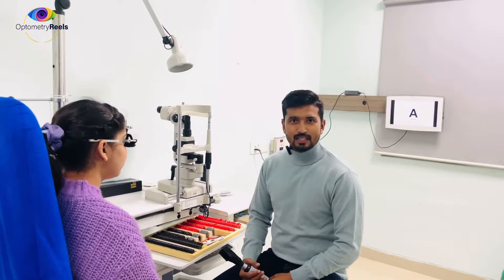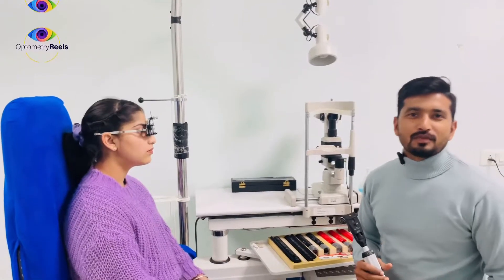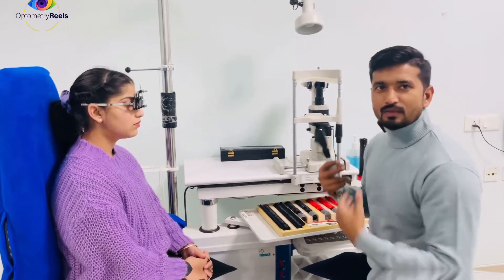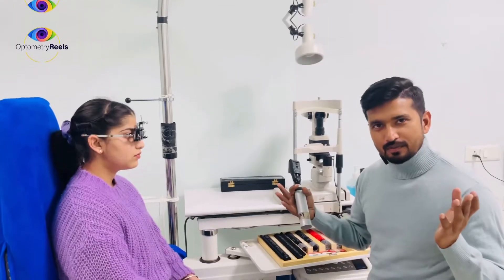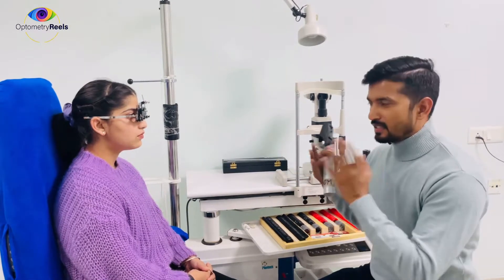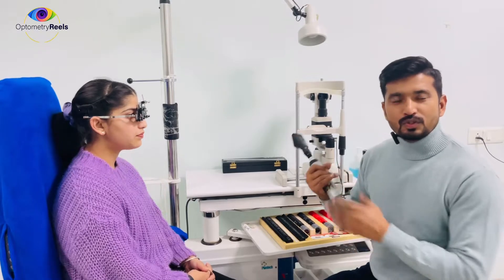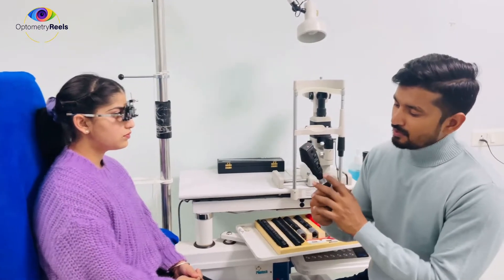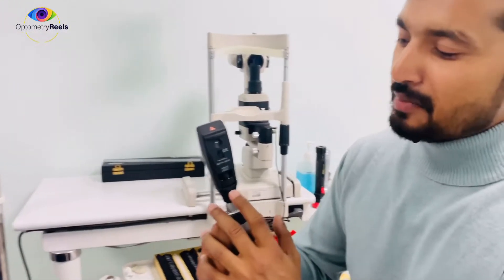Hello, welcome to part 2 of retinoscopy. Today we are going to learn how to neutralize the astigmatism using the sphero-cylindrical method. The basic rule of retinoscopy will remain the same. The room has to be de-illuminated and the steps we follow in retinoscopy will remain the same as we neutralize the astigmatism. I am going to use the right eye only, but another thing I wanted you to understand is the mirror effect.